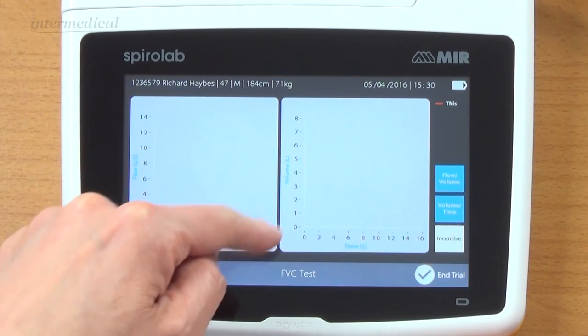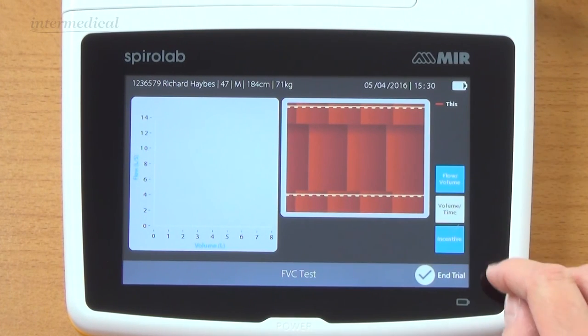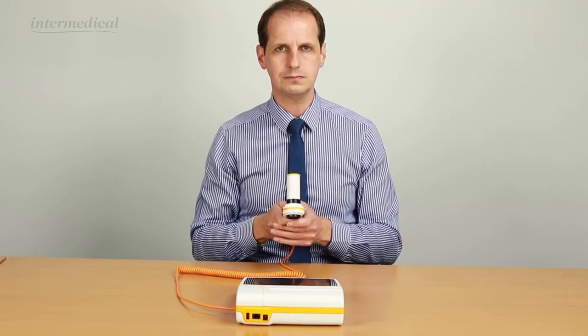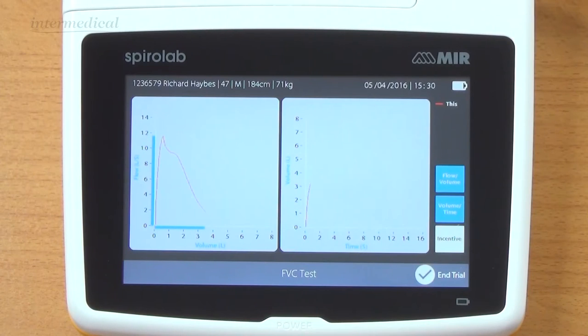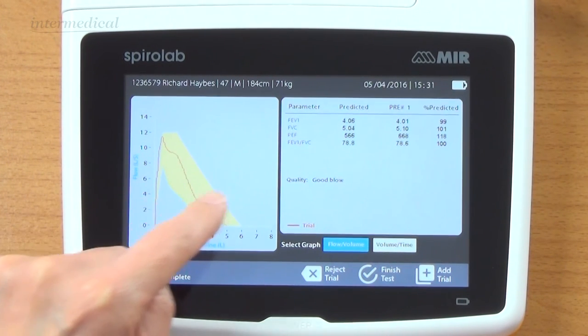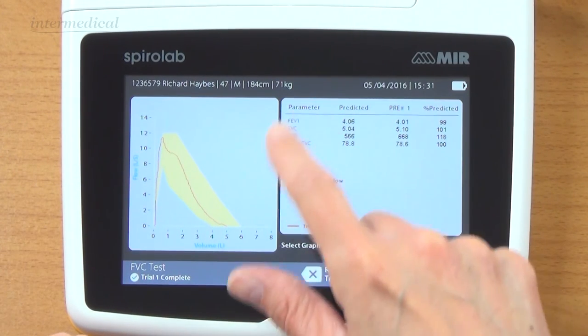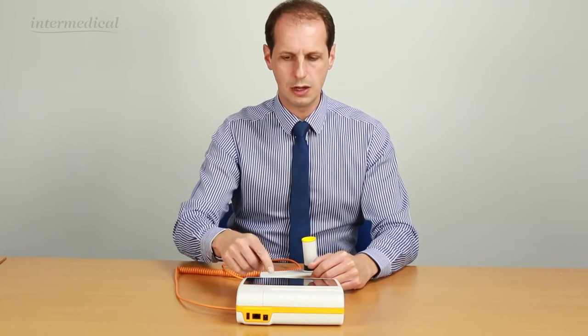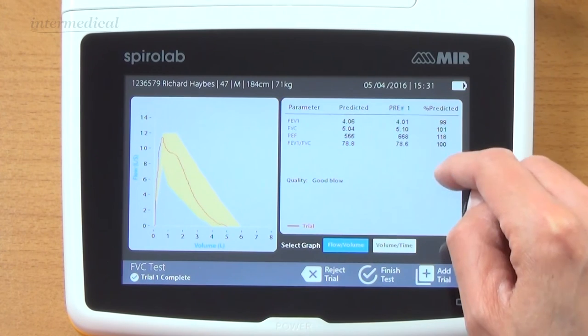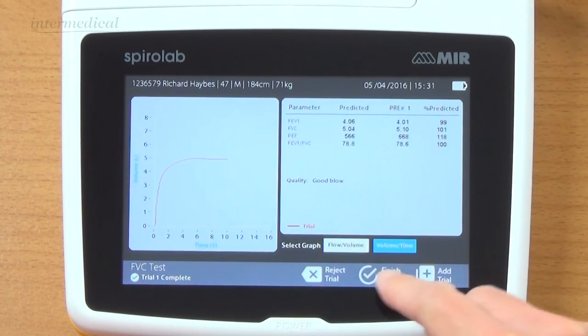I click on that option. We get the flow volume and volume time graphs on the screen. There is an incentive feature - a curtain which moves across and exposes the picture behind - but I'm just going to use the graphs. So I've done my first test. You can see the predicted area based on my details. Over here we get the basic parameters: FEV1, FVC, peak flow, and the ratio - with predicted, current best, and percentage predicted. It tells us it was a good test, and will indicate a slow start, abrupt end, or possible cough. We can also look at the volume time graph.